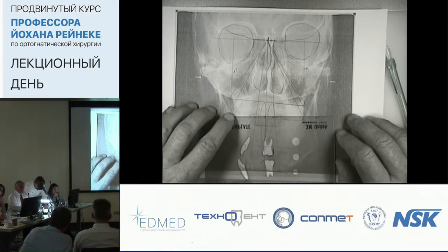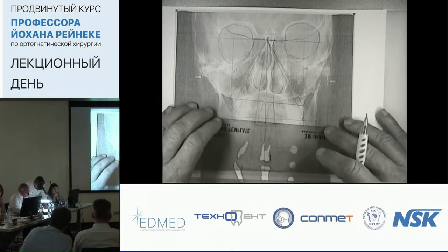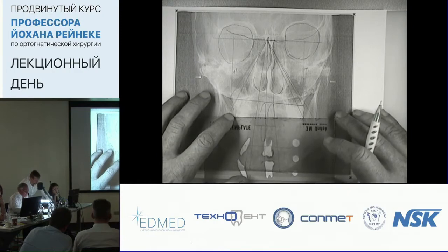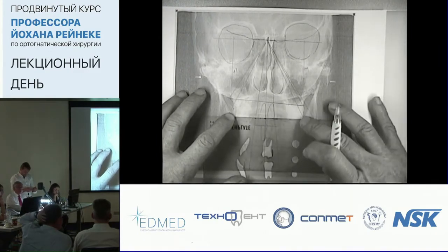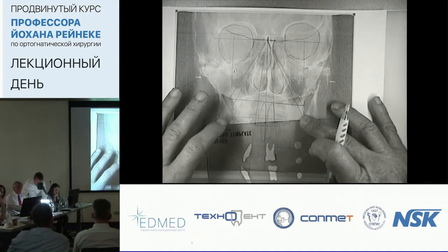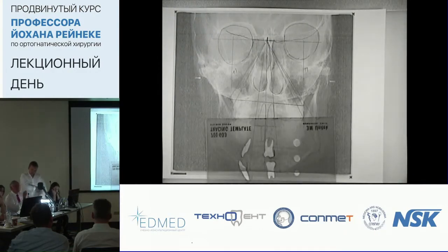Now can you see what happens where the tooth is. If I'm going to rotate around this area here, I want to correct that. You see that the tooth will shorten. That's the first thing. If I'm going to downgraft only on this side to get the cant corrected, the tooth will lengthen. Okay? The other important thing is, if I rotate, the midline is going to shift to the fixed point.